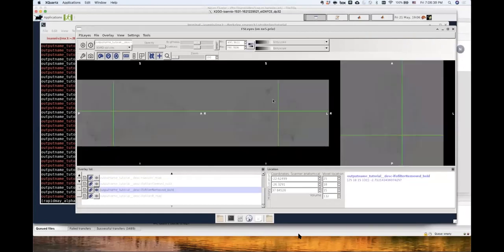This is the regressor that rapidtide has been removing from your data. This is different from other types of denoising strategies, because this is a voxel-wise specific regressor that is being removed. That regressor comes from cross-correlating each voxel's time activity over a range of lags with the initial probe regressor.